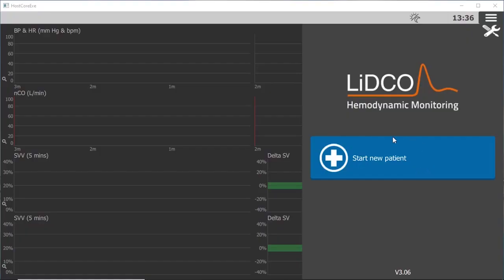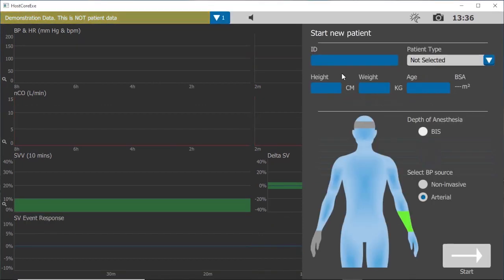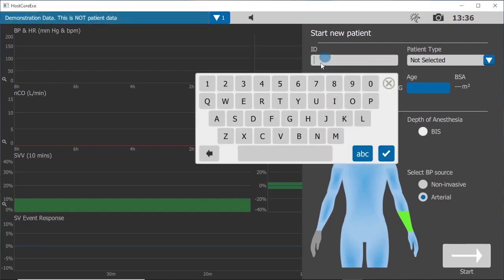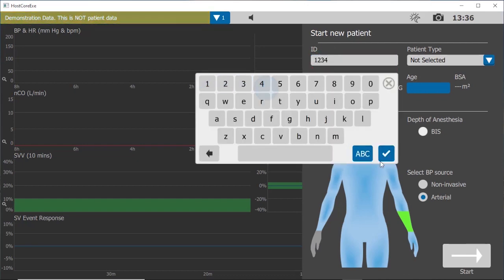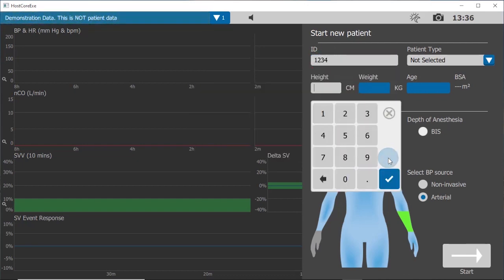Now touch anywhere inside the Start New Patient box to begin a new monitoring session. Select ID and enter medical records number. Check.